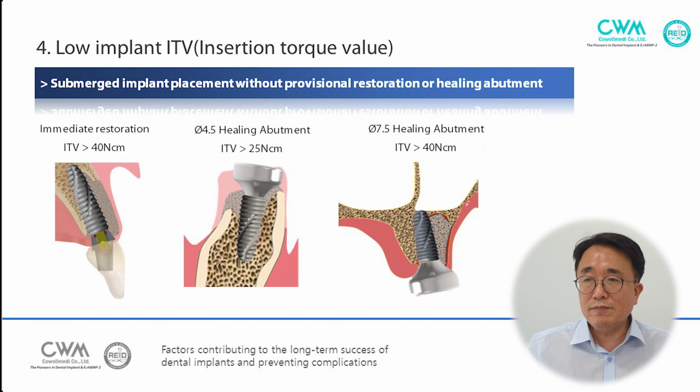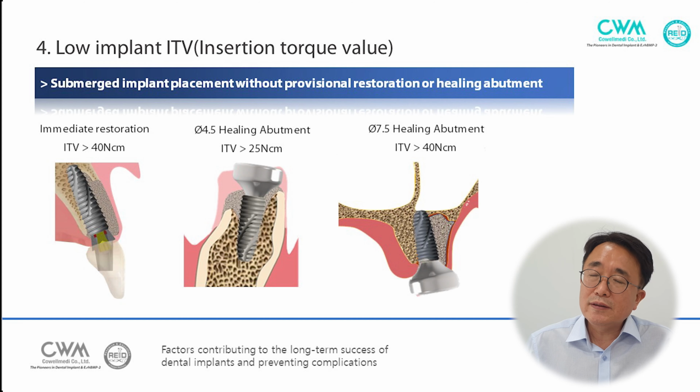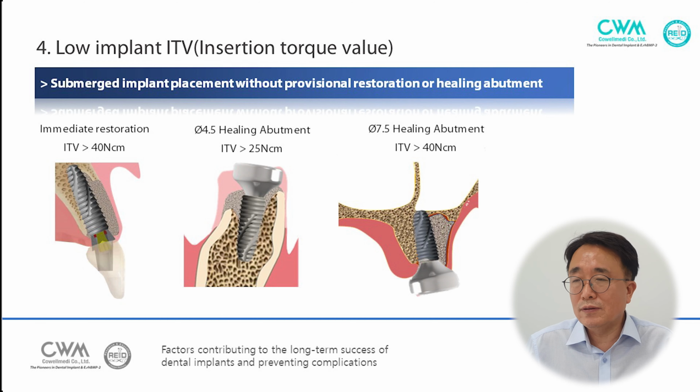But if ITV is under 25 Newton centimeter, I recommend a cover screw or just crestal-level conventional healing abutment length.